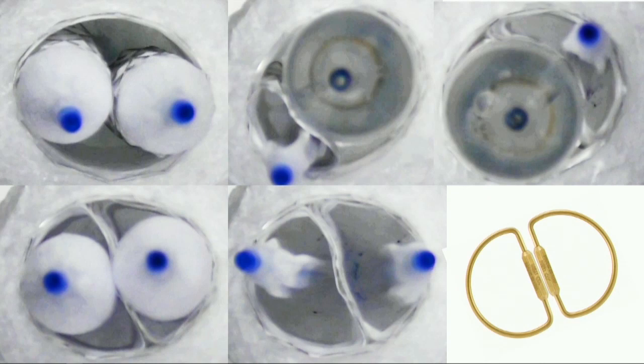I will summarize again. Initially, you perform the kissing balloon technique like this in the aorta. Then a bigger size balloon is used for ballooning like this. Then kissing balloon technique again. Then you can easily make a D shape like this.